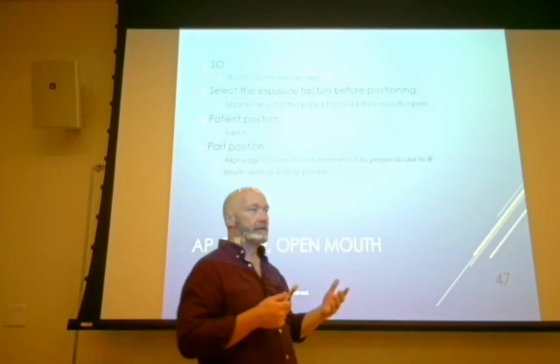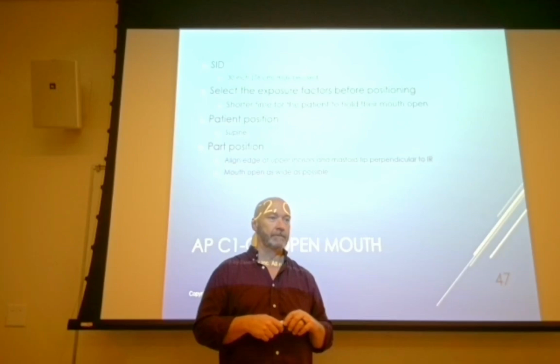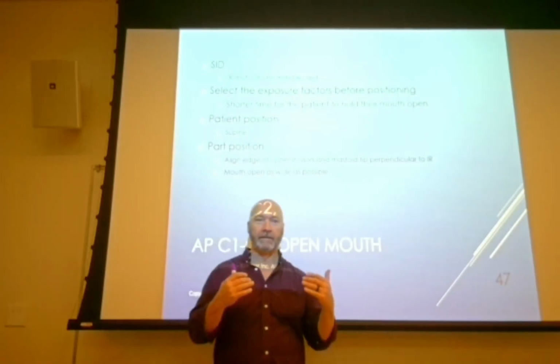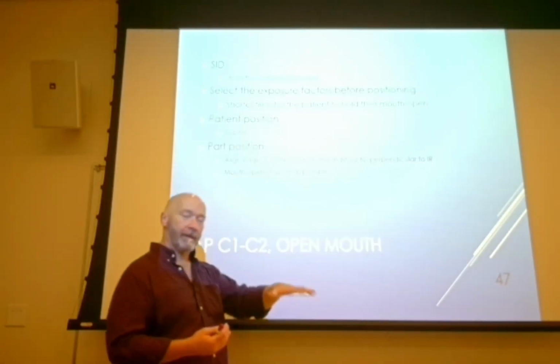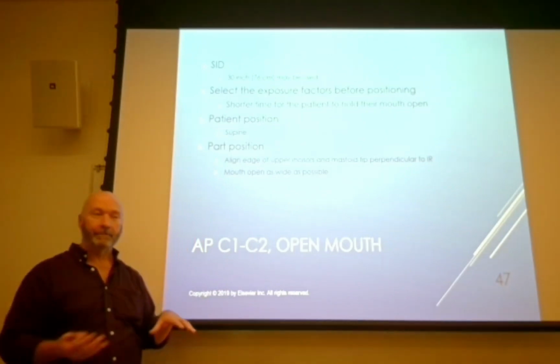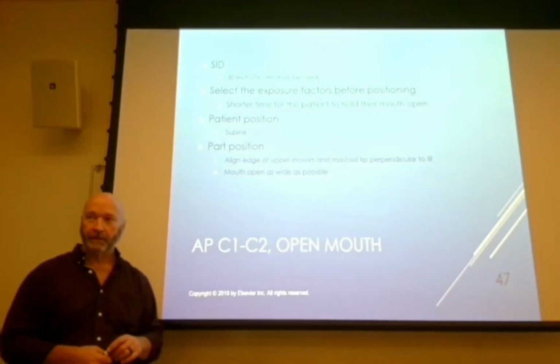I say that because sometimes you can tell somebody to open their mouth real wide. What do they do? Exactly. So you get everything positioned properly, and then you say, I want you to open your mouth real wide. No. You've got to reposition, right? So maybe just put your hand on their head and say, okay, I need you to drop your chin. Might be a better explanation of what you need them to do.